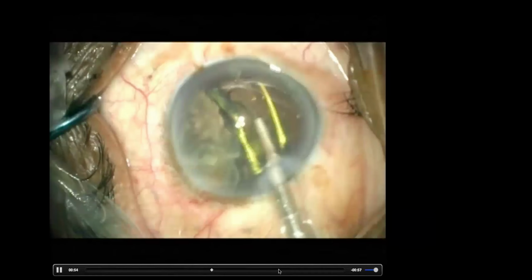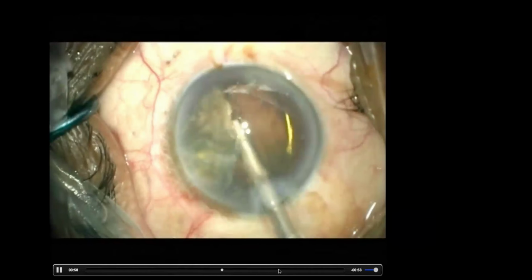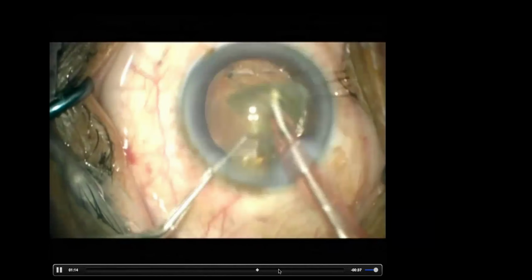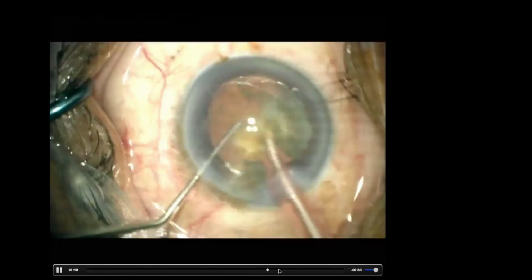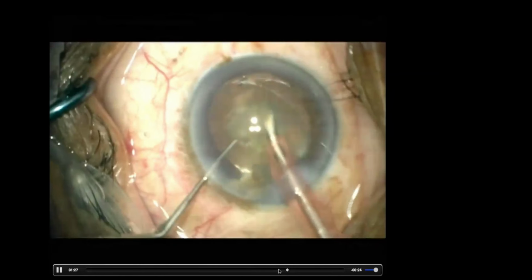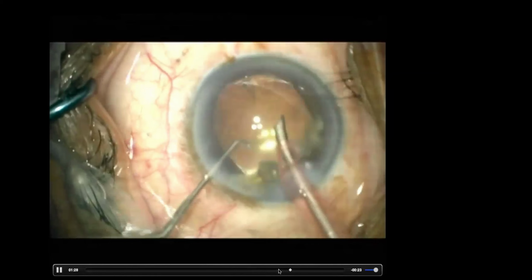Because if you fragment it, a small fragment can drop into the vitreous. Try to catch the whole fragment and phaco it, rather than trying to break it into pieces while you have a small capsular rupture. With a capsular rupture, it's better to catch the total lens fragment and phaco it, rather than trying to break it, because if you break it, a small fragment will get released into the vitreous. So this is another way of preventing vitreous loss and managing remaining lens fragments.